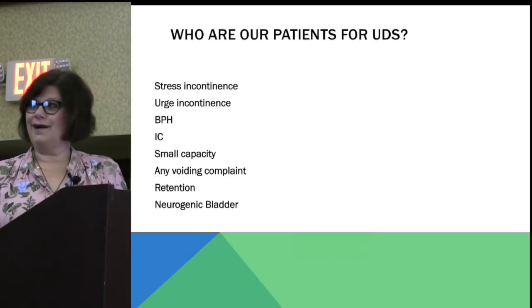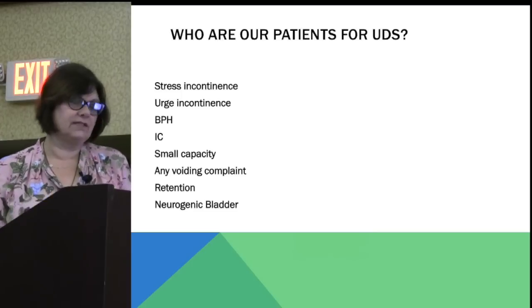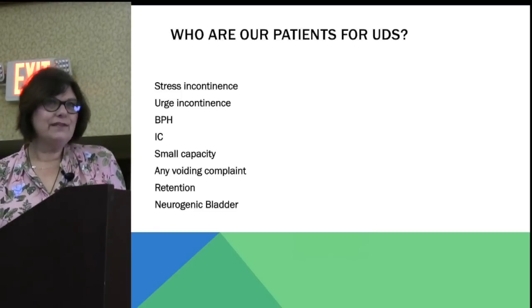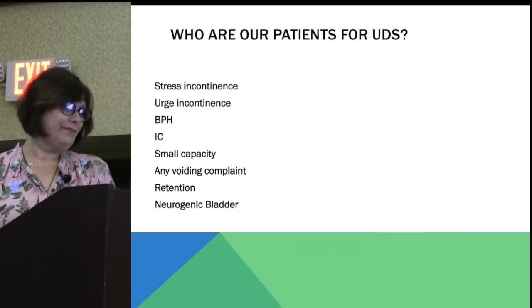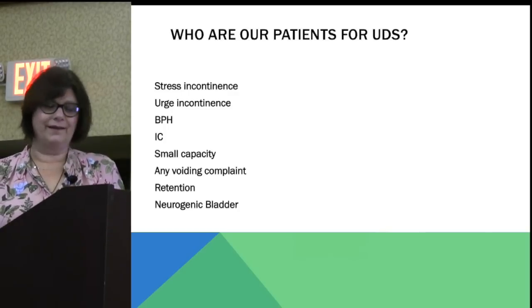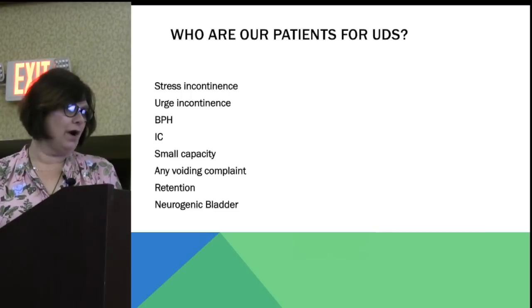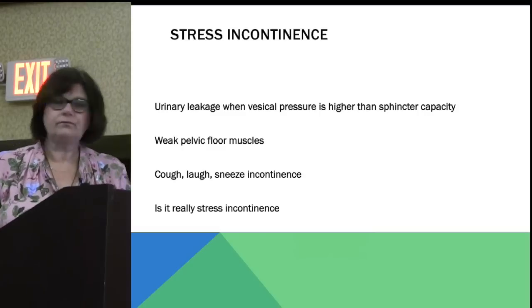We don't want people with overly full bladders to be getting reflux back into the kidneys and causing damage. So it's a fairly simple test once you've gotten used to doing it. And you get, again, a great amount of information and a great way to figure out how to move forward with treatment for these patients.